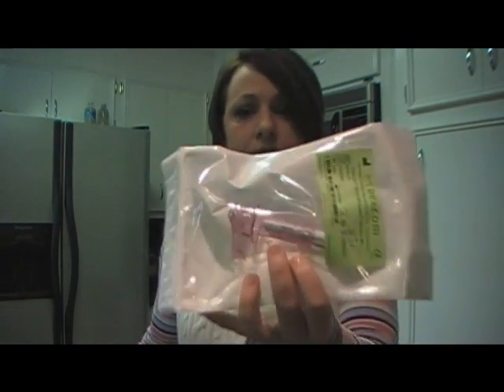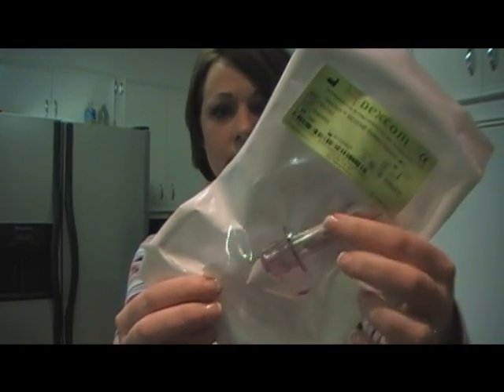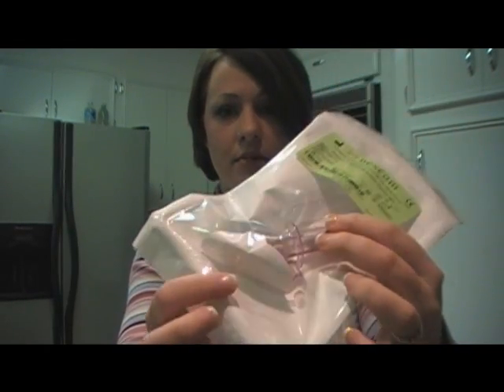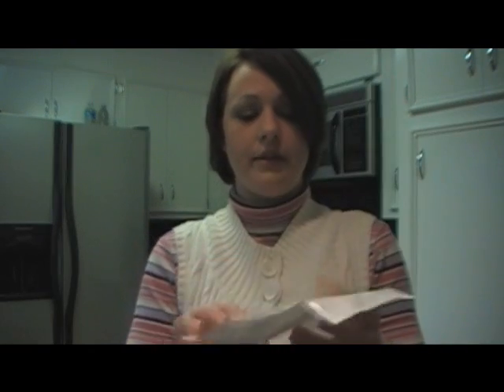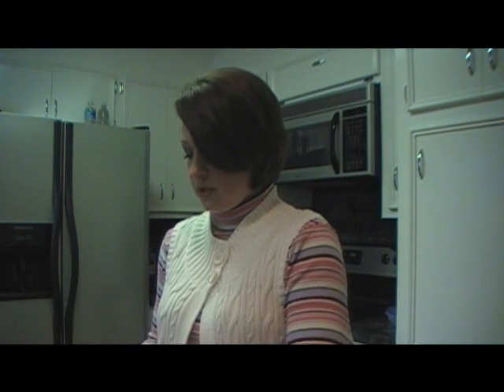When you get it, this is what it looks like — the little applicator and all that's attached to it, and then this is the bottom piece. I like to keep this on the table, just so that I know it's a clean surface, because you really don't want this to get contaminated.